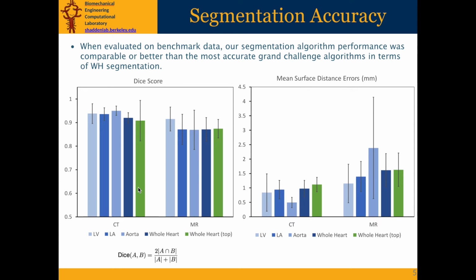in green. Our segmentation algorithm performance was better than or comparable with the state-of-the-art algorithms in terms of whole heart segmentation for CT and MR, respectively. Moreover, our LV segmentation in particular was generally more accurate than whole heart segmentation.